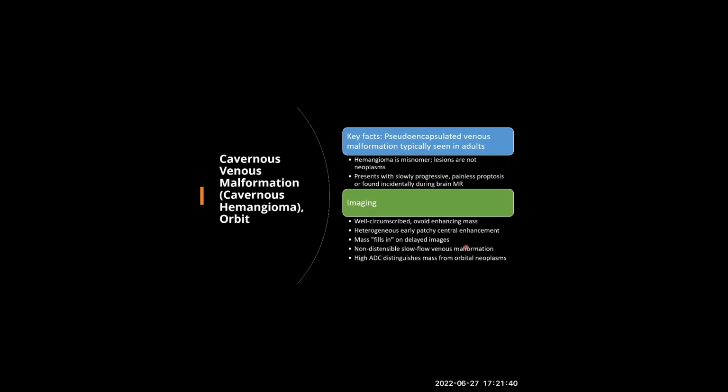Next is cavernous venous malformation. The vascular structures in the pediatric can be inborn, like the hemangioma, which decreases and regresses with aging, and the other vascular structure is a cavernous hemangioma. All of these are considered vascular malformation now. These structures can happen.